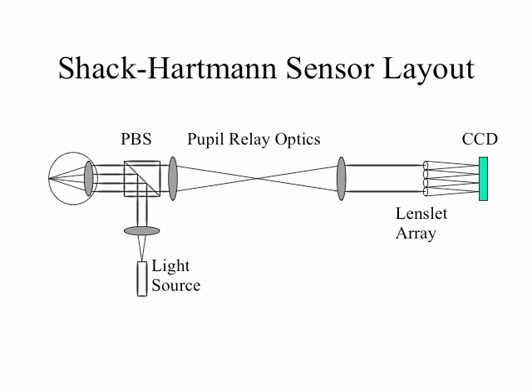This is an example of a device that might produce such a measurement, and the only thing that you see here that's different from what I've described is that there's a beam splitter to illuminate the eye in a coaxial fashion. Well, there is one other thing, which is this.